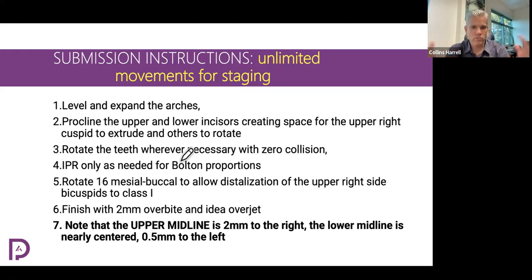Because there's going to be no collisions, because as you push them outward, it creates space. So if I was pushing them inward, they'd be banging into each other, okay? But pushing from the lingual to the buccal, there should be nothing interfering with that. So as long as the patient's wearing the aligners and the teeth are not ankylosed, they should move. If you see that simple movements like tipping crowns to the buccal is not happening in your patient, they're not wearing the aligners, because it is the most predictable, simple movement to do, which is why we used to call these appliances tip and strip appliances, because you could tip the teeth out really easily and then strip to create space. All right. We don't call them that anymore because we do a lot more with aligners now than just tip and strip. Okay.